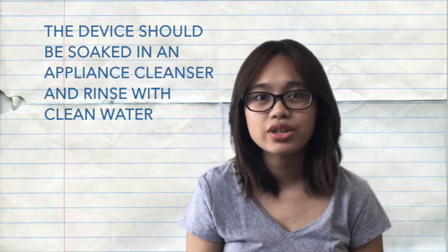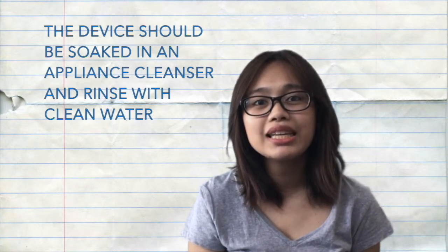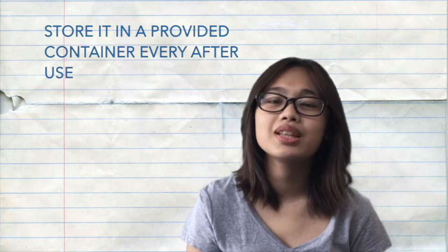It should also be soaked in an appliance cleanser and rinsed with clean water. And after cleaning the device, you should store it in a provided container so it will be ready when you want to use it again.